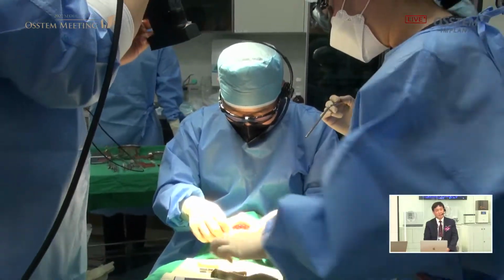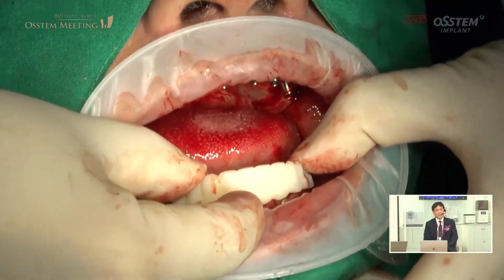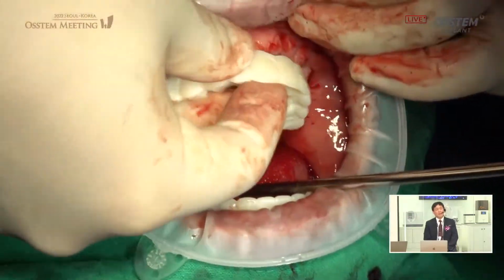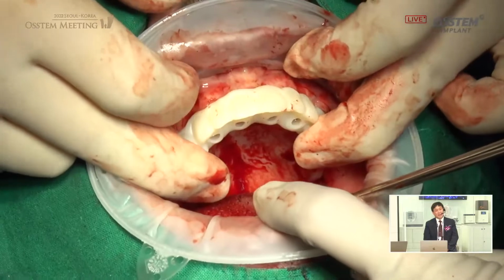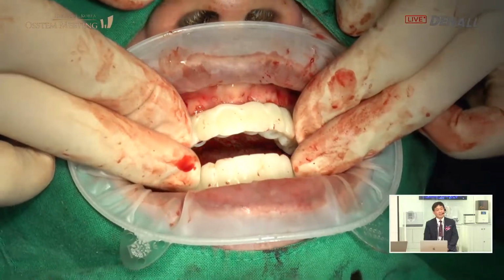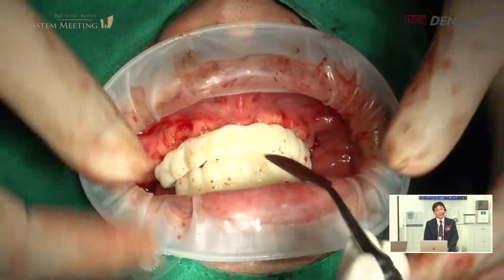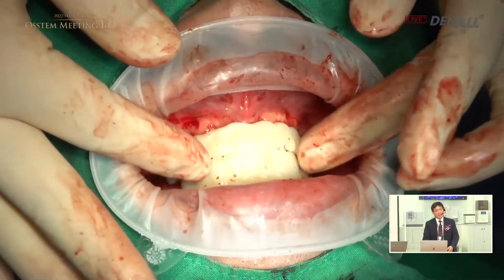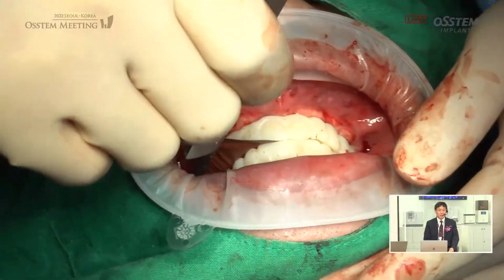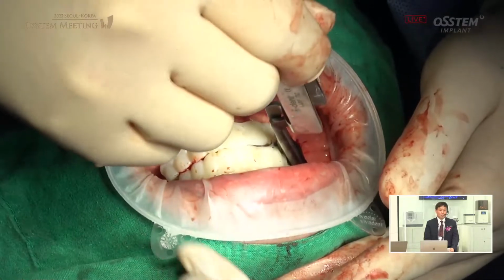So this is the mandibular prosthesis that we tried in before. So it is adapted and the maxilla. So it went as planned. Please close your mouth with your molar. So it went well for maxilla as well. Would you open it a little bit, please? Close your mouth. He's checking the bite.